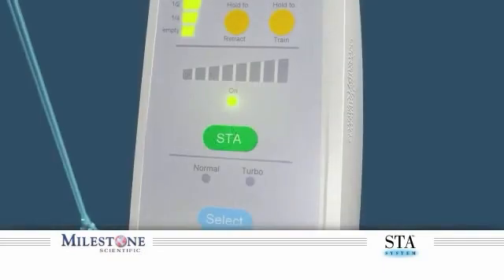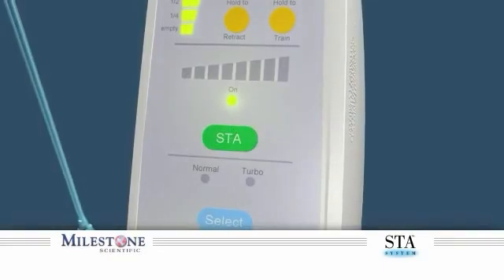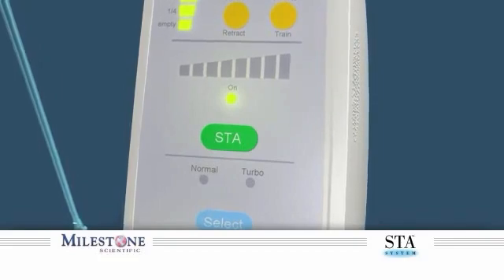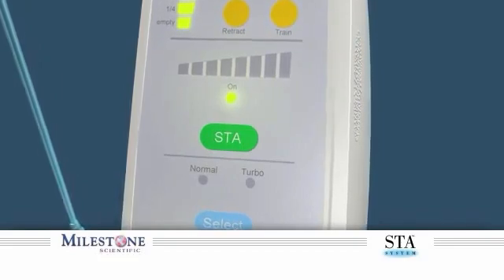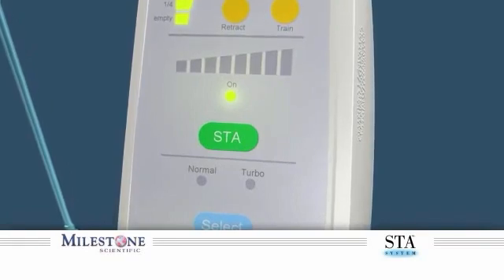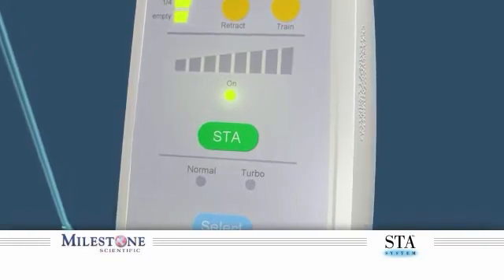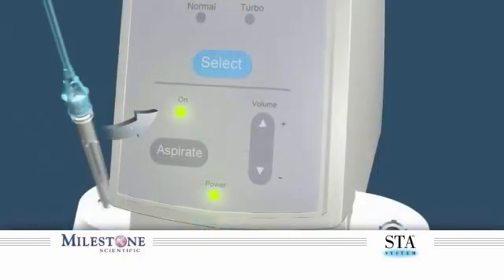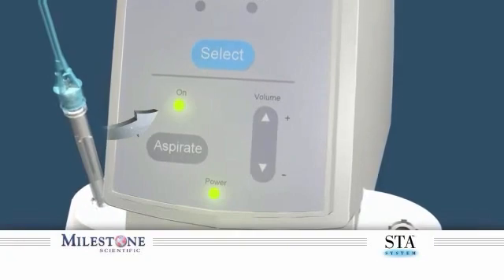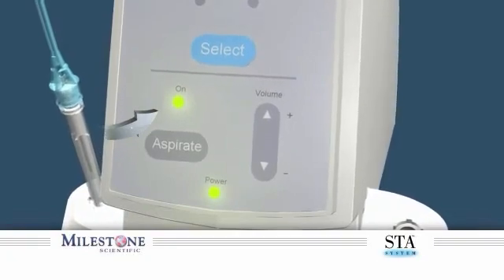Please note it is critical to use the STA mode for this injection to ensure that a safe and controlled single flow rate is maintained throughout this injection. Delivering the anesthetic at a faster rate than the controlled flow rate can cause adverse tissue reactions and/or tissue damage. Make sure that the aspiration feature is on, as an aspiration test may be performed during the anesthetic delivery.